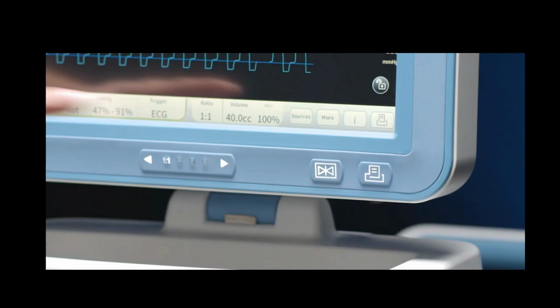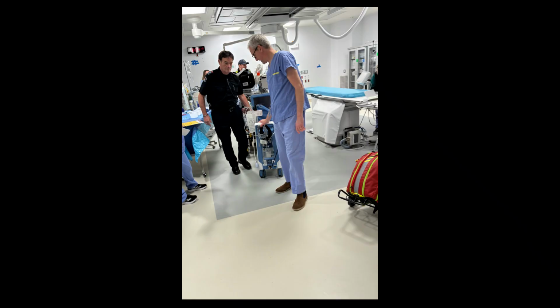Patient transfers are the most risky procedure for dislodging the balloon. The team should move together to prevent any accidental tube dislodgement. Ensure that the RN has a view of the monitor during the entire transfer. The IC will continue to monitor the IABP console.